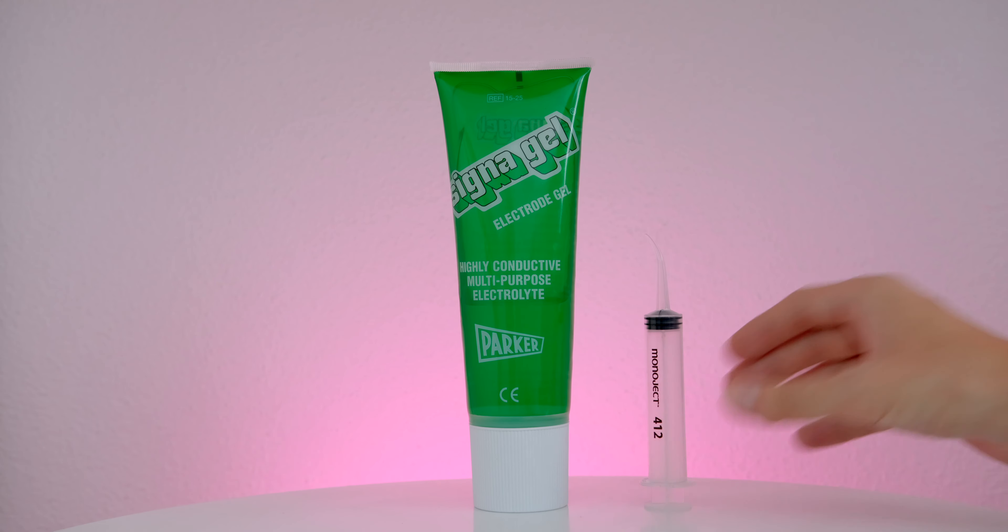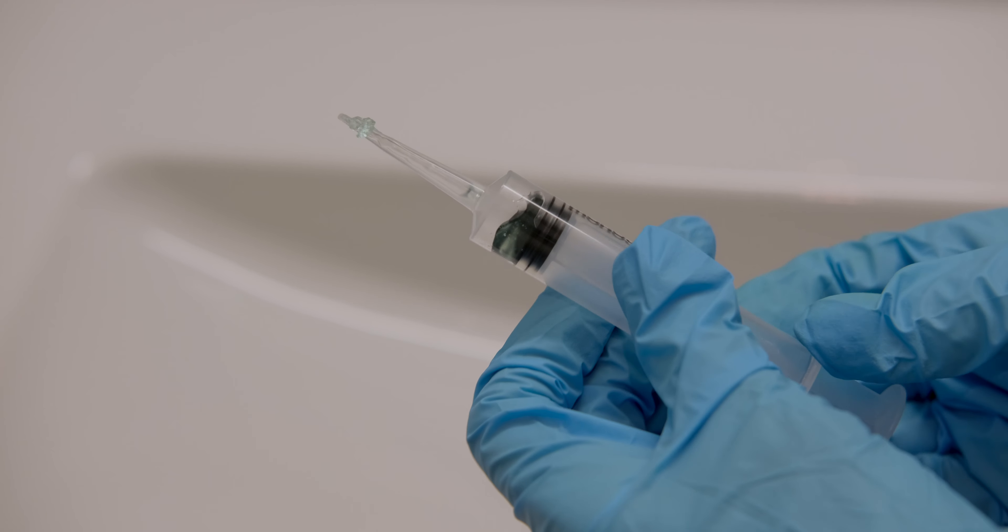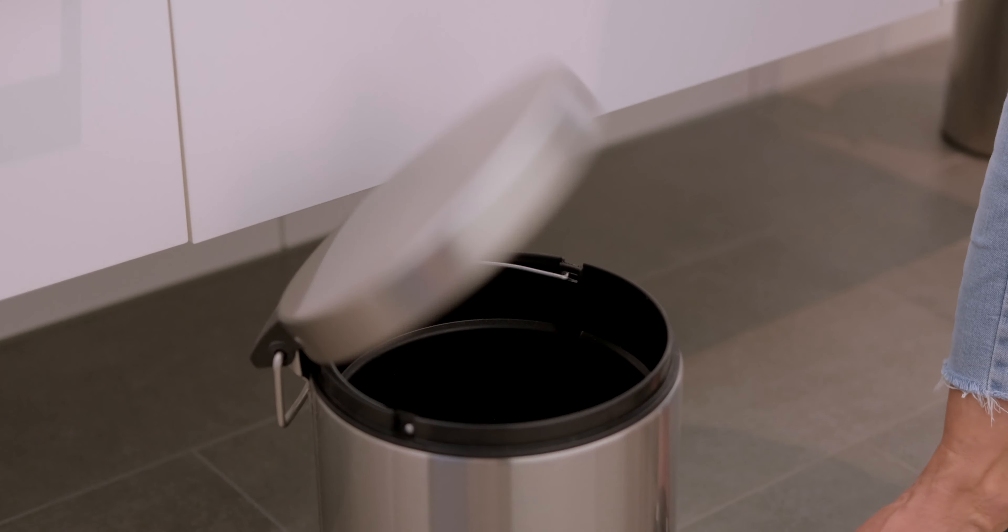For the syringe, if there is any residual gel left in it, we recommend throwing it away, as reusing the syringe and/or the gel could cause contamination. Follow these simple steps and you're ready to safely start your next acquisition.